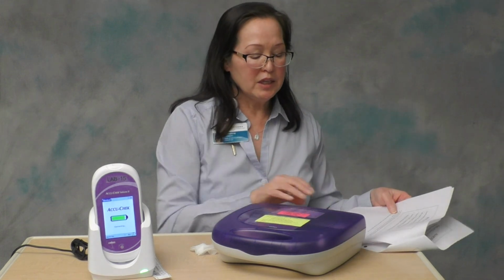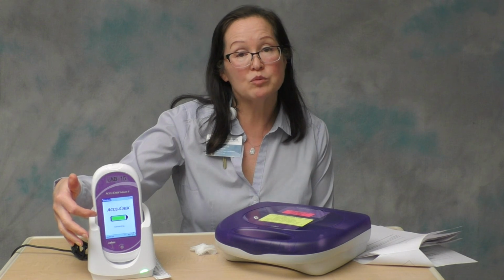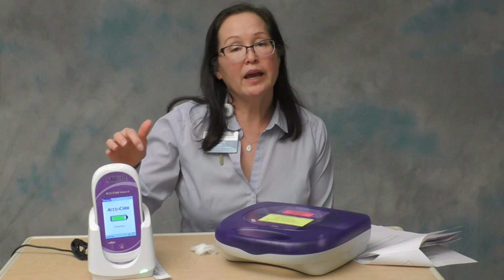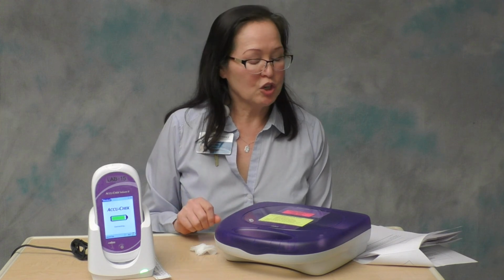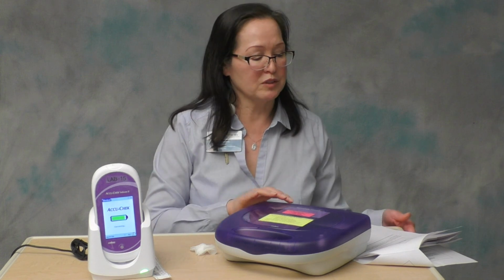Now, the third option that you have from the main menu is that you can review test results. This might be handy if, for example, you forgot what the actual value was before you manually documented in the patient's chart. You can go back to that meter and look up the test result. Review results will allow you to sort the results on that meter in between patient results and QC results, and then you can touch an individual line to get more information on that test result.